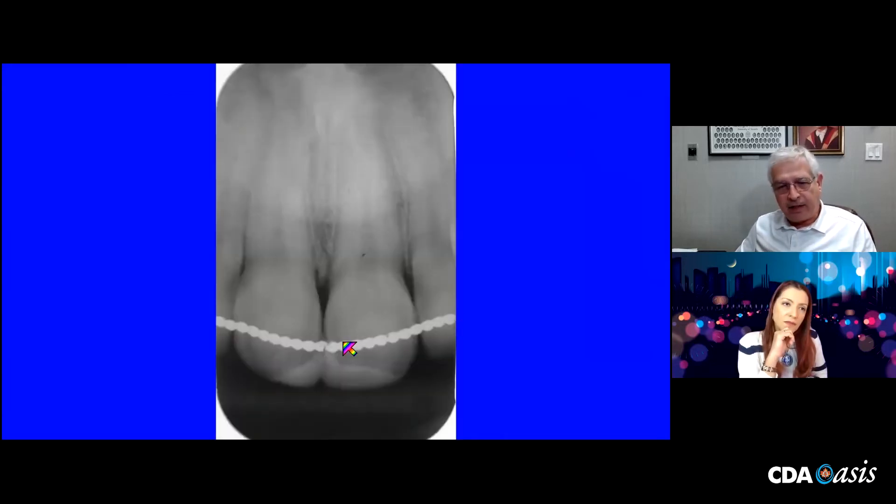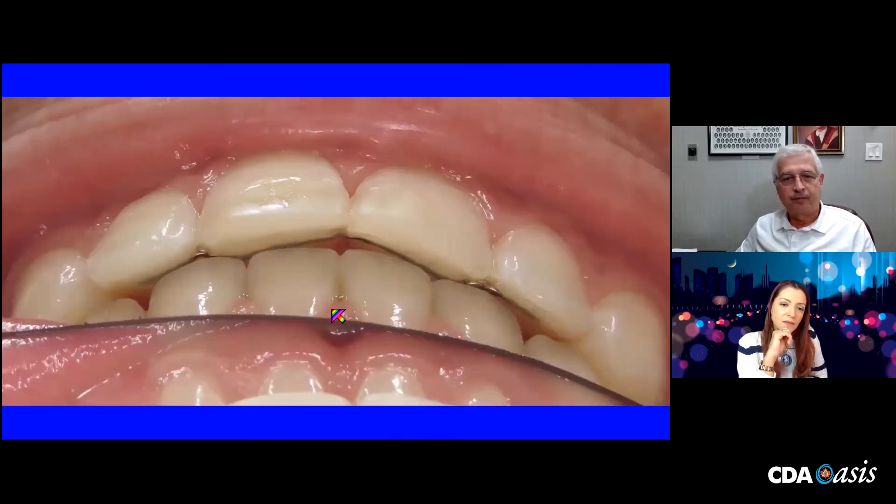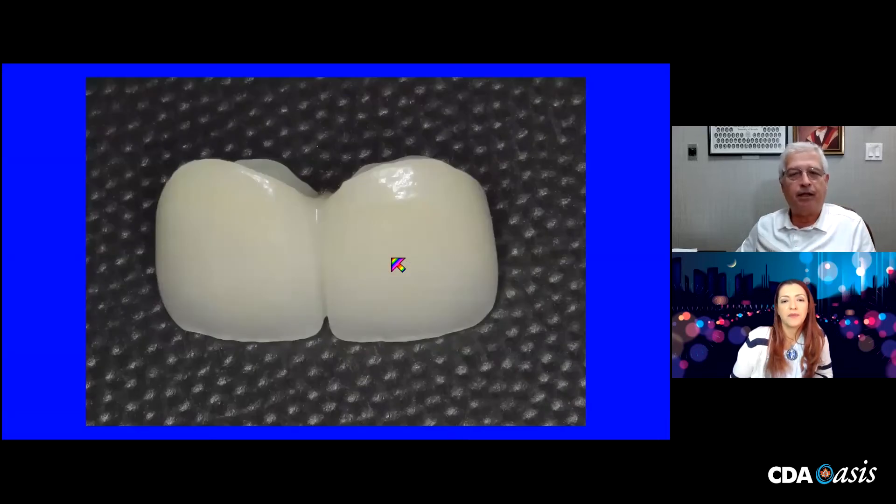He had different retentive wires of a different configuration — there was a little break here. I don't know whether that was purposeful or whether it just broke from fatigue. There you can see the occlusion. So whatever I put here, I have to worry about retention of the incisors — that was made clear to me by the orthodontist. So two splinted zirconia crowns were delivered.